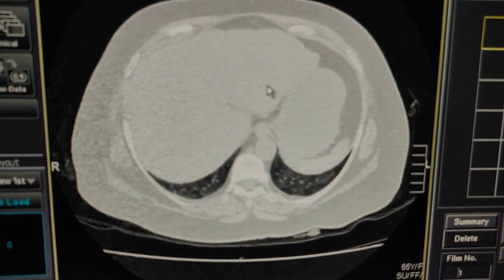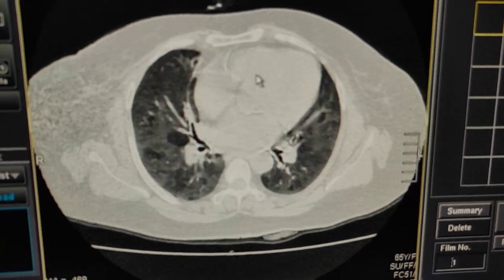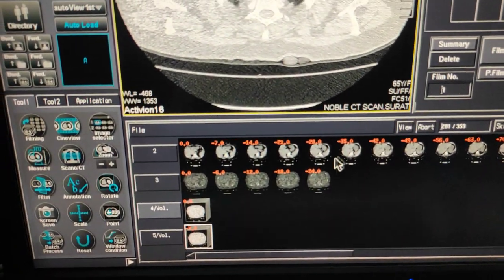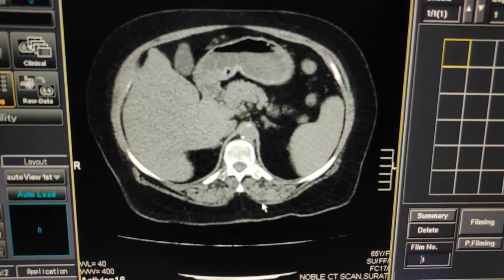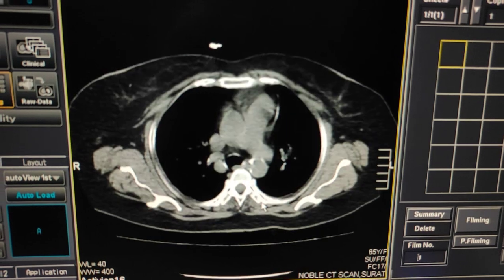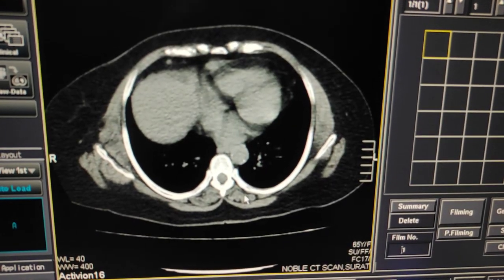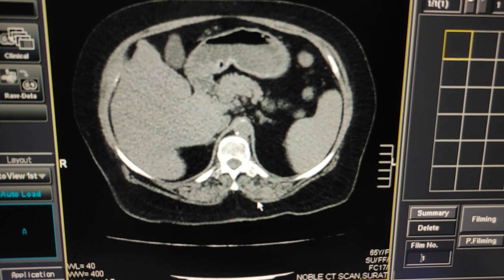This is how you scan HRCT of lungs. Also check the mediastinum window — you should always check the mediastinum window. Sometimes you are doing an HRCT scan but there may be lymph nodes enlarged — you should always check for lymph nodes in the mediastinum. We have covered up till D12, so this is the complete scan for HRCT lungs.